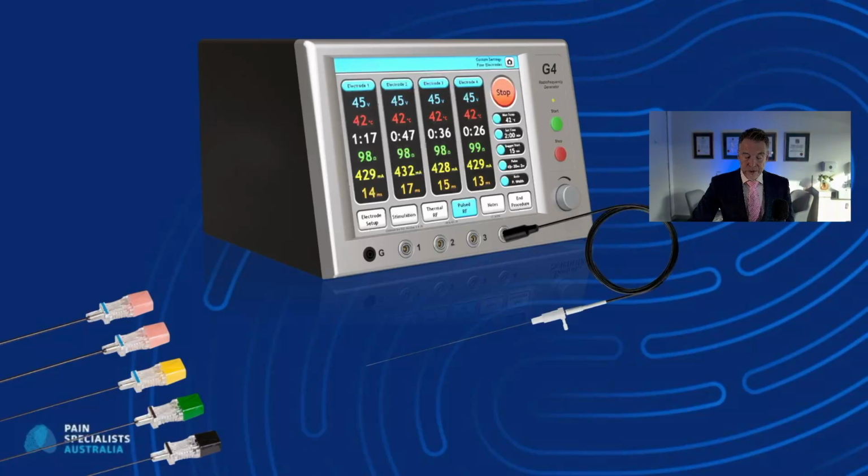So what is radiofrequency neurotomy? Well, effectively what it is the application of heat through the end of a needle once the needle is placed in the appropriate location. You can see on the left-hand side there are a number of different needles, sometimes big needles, thin needles, long needles, short needles.